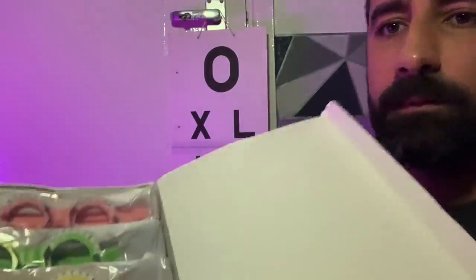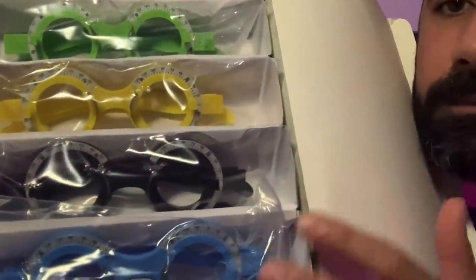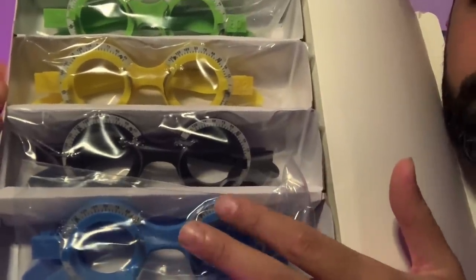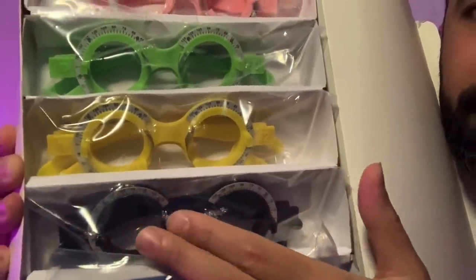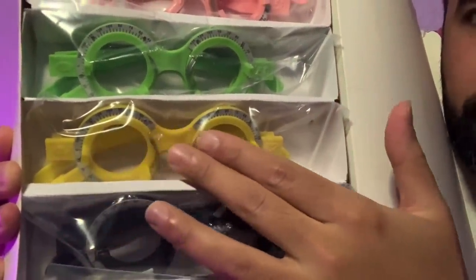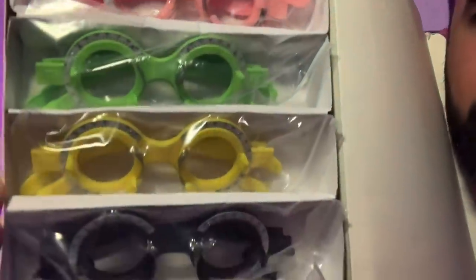Before we begin the refraction, it's very important that we select the appropriate trial frame for you after taking the interpupillary distance measurement. So, available today, we have these wonderful trial frames. Blue trial frame here. We have the black, beautiful black. We have a bright yellow. We have the green here and the pink at the top.